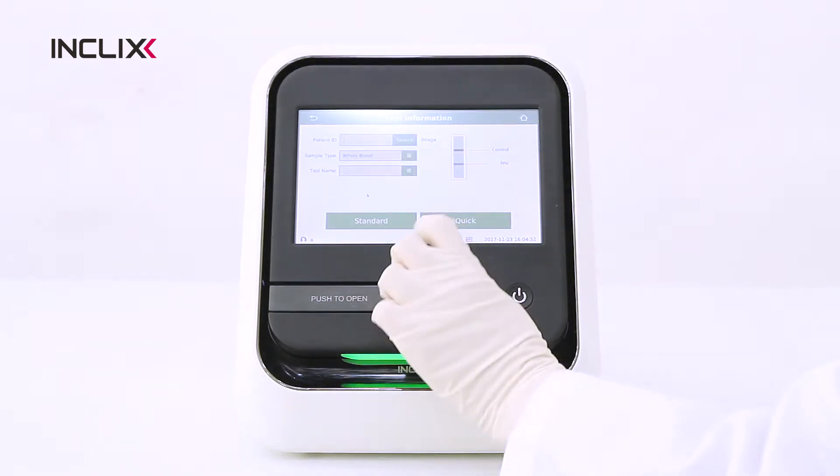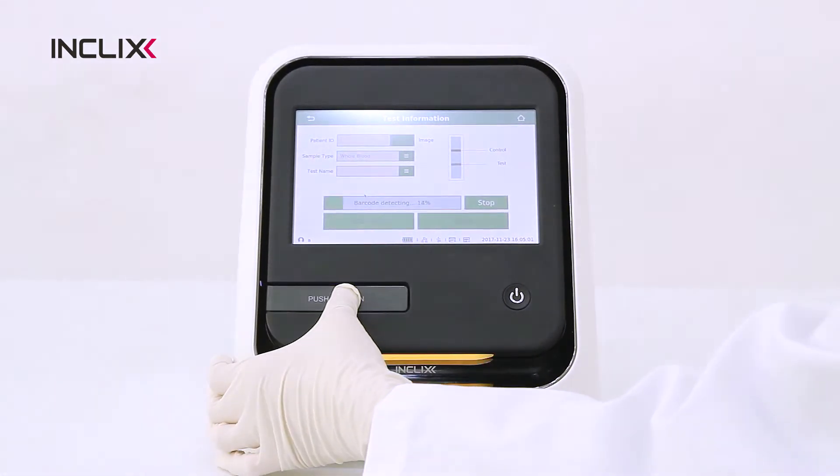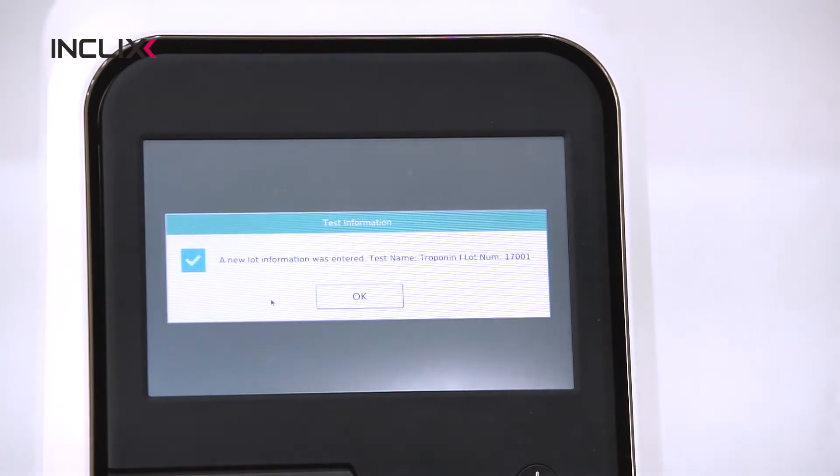Press the Test button. Open the cassette tray and insert the test ID QR code. New lot information is automatically entered.